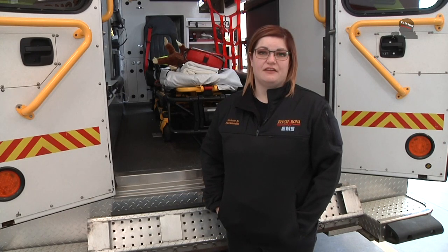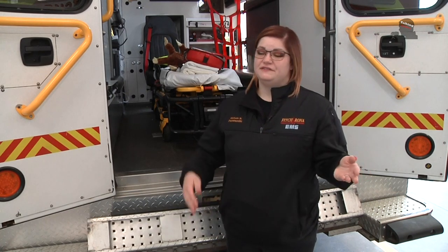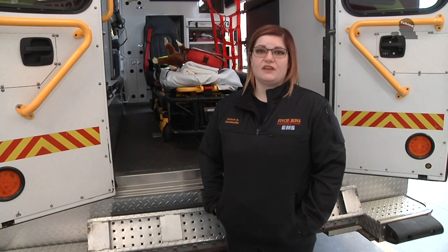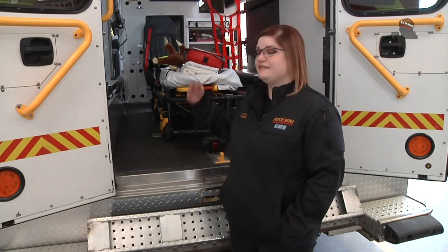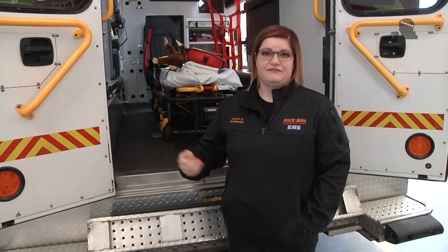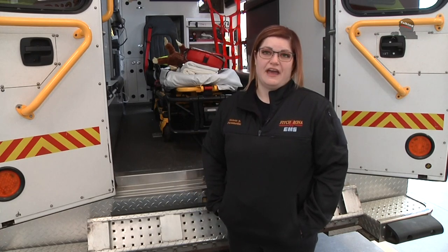So with Children's Health Alliance of Wisconsin, we discovered that we needed a more efficient and effective way to transport infants from the weight of 5 pounds up to 14 pounds, essentially the itty bitty babies that we would typically transport in their own car seats. So to do that, we got the NeoMate, which is essentially a car seat that straps to the cot that allows us to position the infant as needed, as well as care for them with their airway, do CPR, provide medication, start IVs, and just general monitoring.